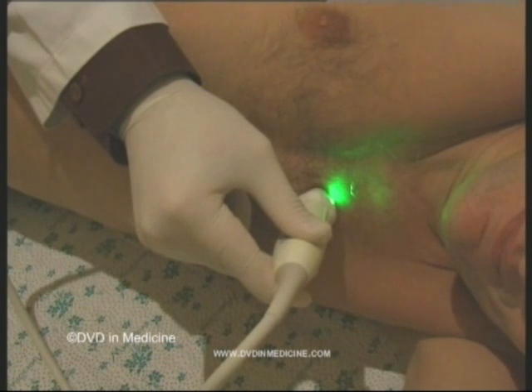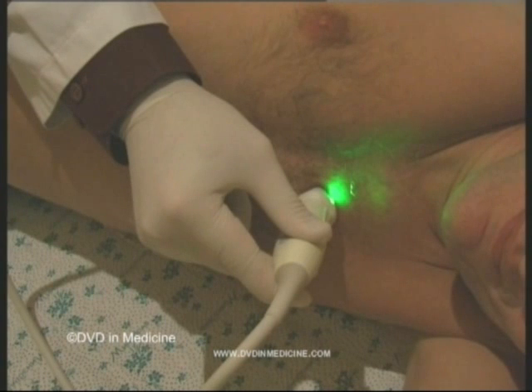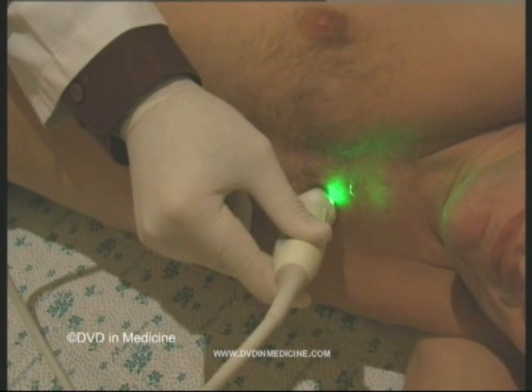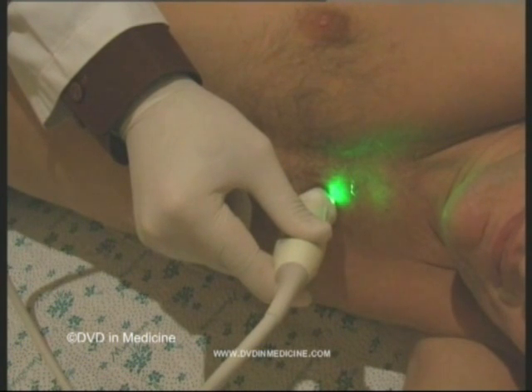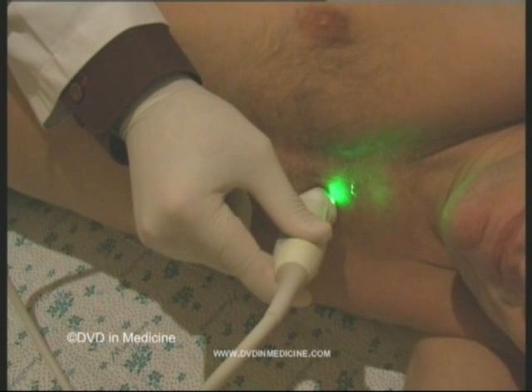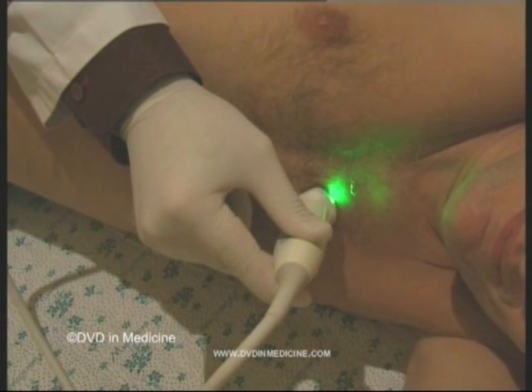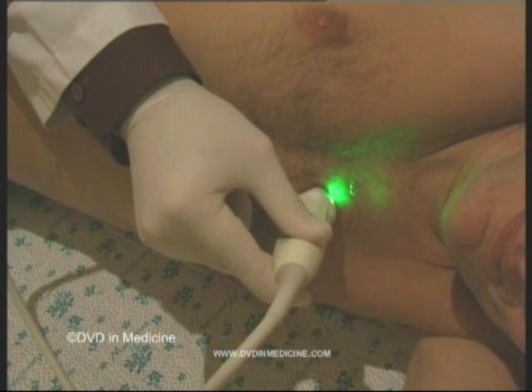The scanning plane should follow an imaginary line that connects the apex and the middle part of the right clavicle. One can perform the examination in the supine position, but it is better to turn the patient on his or her left side.